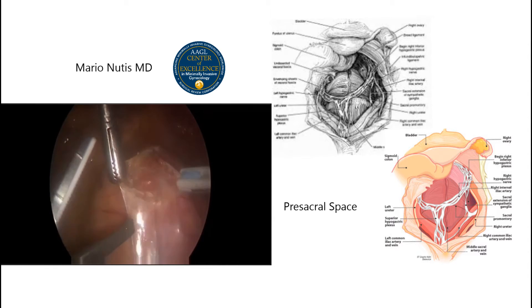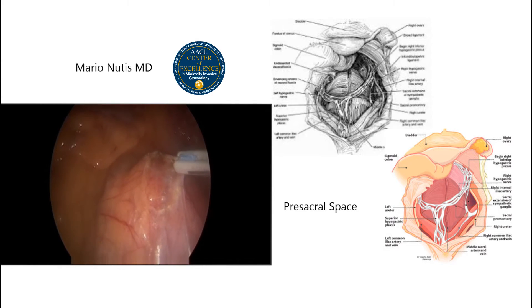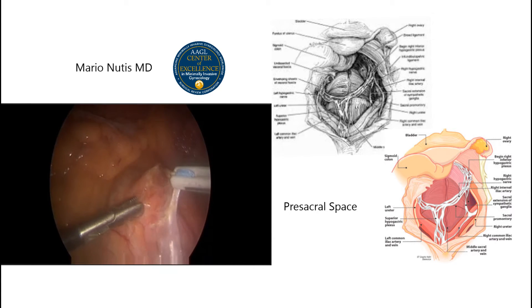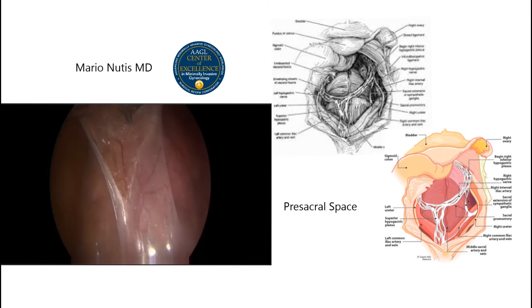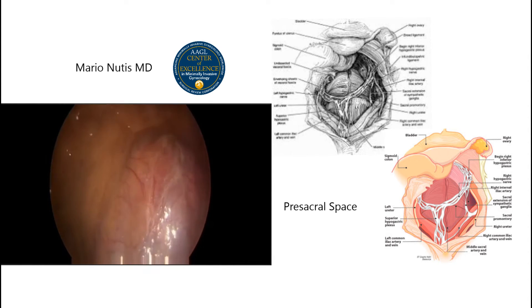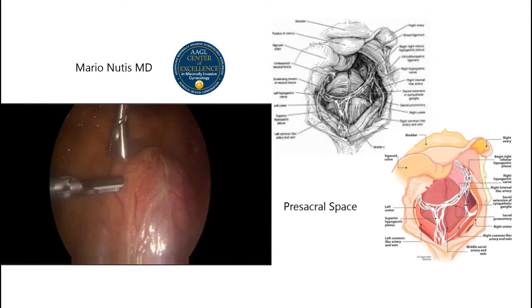Here we're opening the presacral space, opening the peritoneum inferiorly and superiorly. Here you can see the middle sacral vein and artery right here. There are a lot of small vessels that can easily be controlled with a harmonic scalpel or any other type of bipolar energy. Tenting the peritoneum will prevent a lesion to the middle sacral artery or vein.